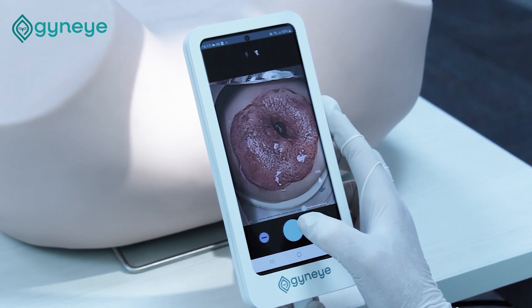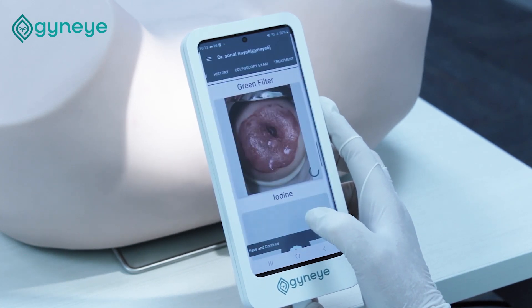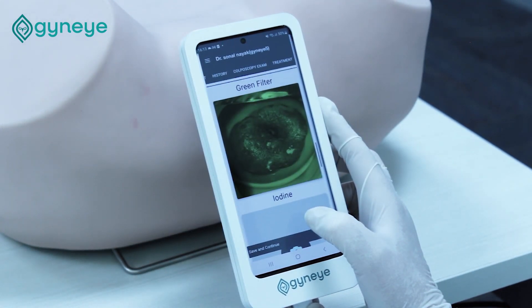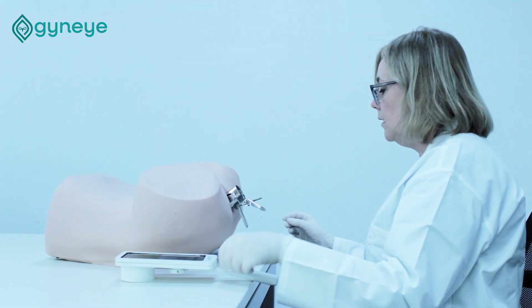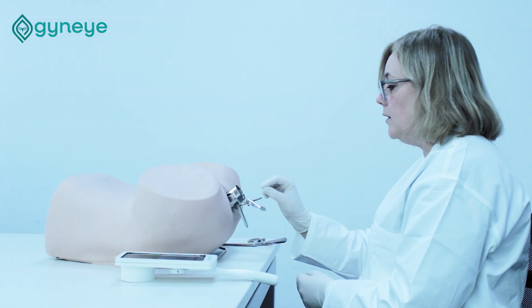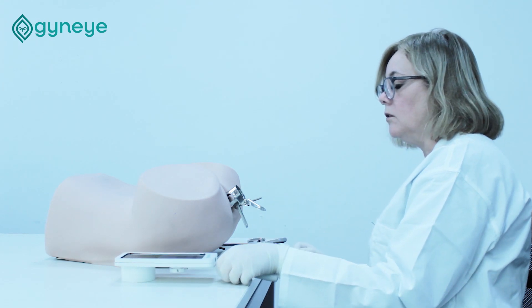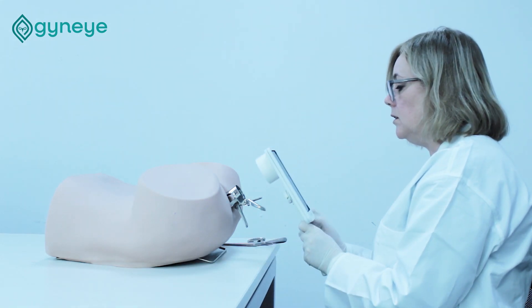The green filter should be applied on the image with optimal magnification to be able to see the vessels. After that, apply iodine and continue the examination to the last part.